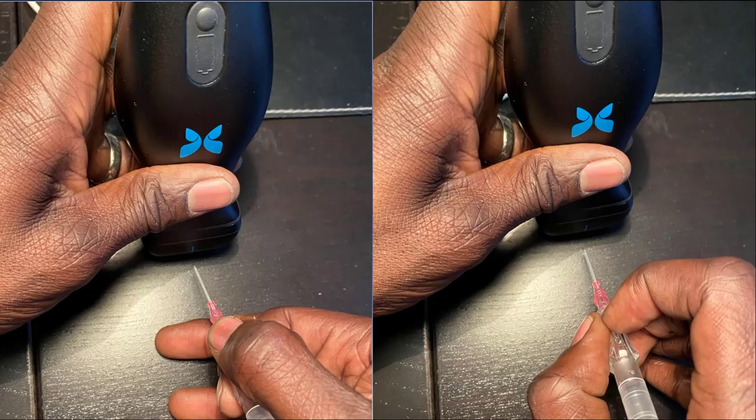You should hold the catheter in your dominant hand. On the left, you see an underhanded catheter grip, and an overhanded grip on the right. As you thread the catheter, especially if you're approaching from a shallow angle, your fingers may be caught underneath. Keep this in mind as you establish your initial grip.